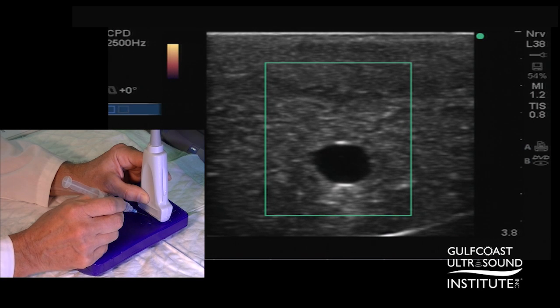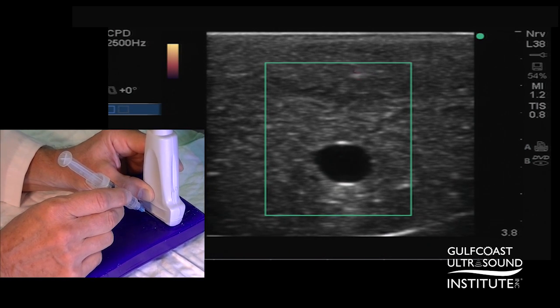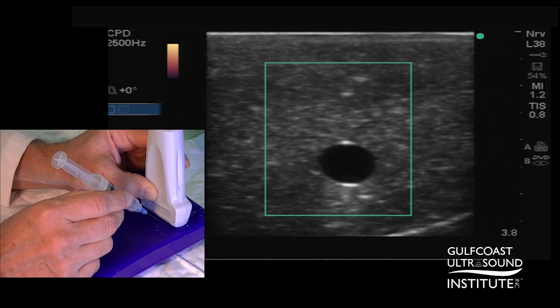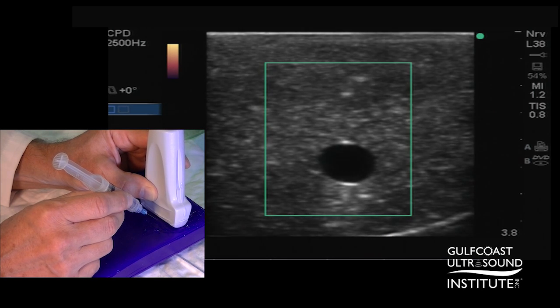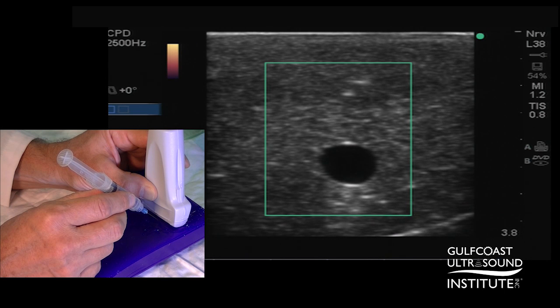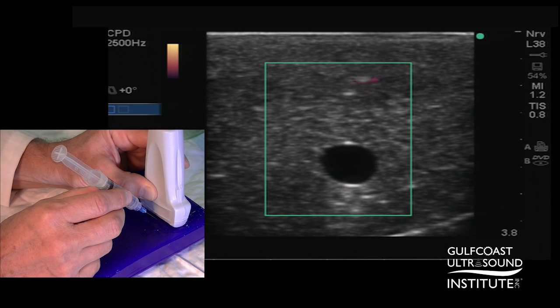I'm going to advance the needle at approximately a 45-degree angle towards the target structure. You can see that as I'm using the fanning or sliding technique to see the needle tip, we can certainly see the needle tip without Power Doppler, but as we agitate the needle tip, you get a bright flash. This is very helpful for finding the needle tip in difficult tissues.